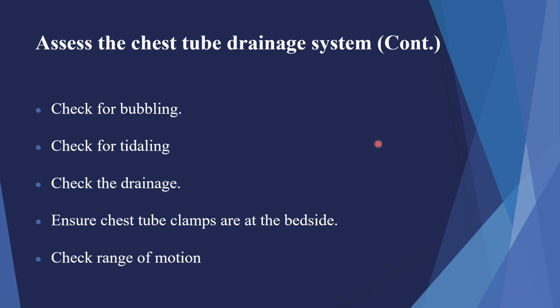If you've got blood draining out of there, especially if you've got a large amount of blood, post-operatively, right out of surgery, anything 200 or more. Honestly, if I was out on a telemetry or med surg unit, if I was getting 100 out an hour, I'd be concerned. I'd be calling the doctor. We need to get blood work ordered, look at their bleeding times and everything, and see what could potentially be going on there, and then get another chest x-ray and so forth.